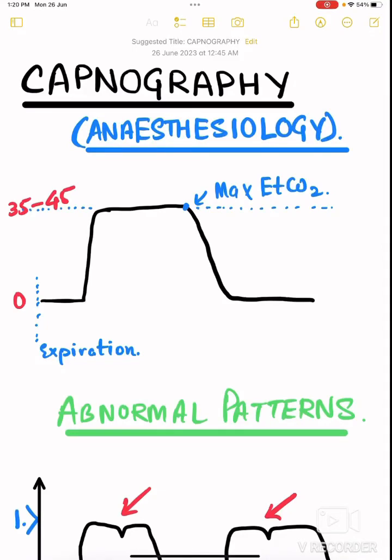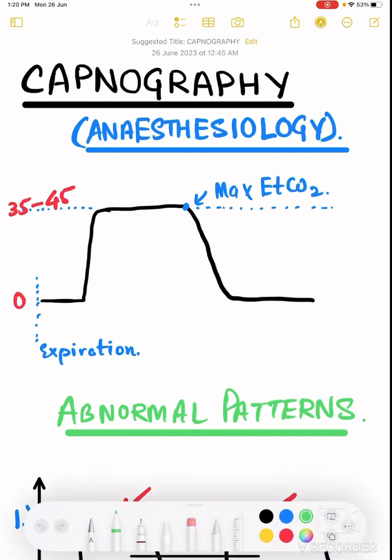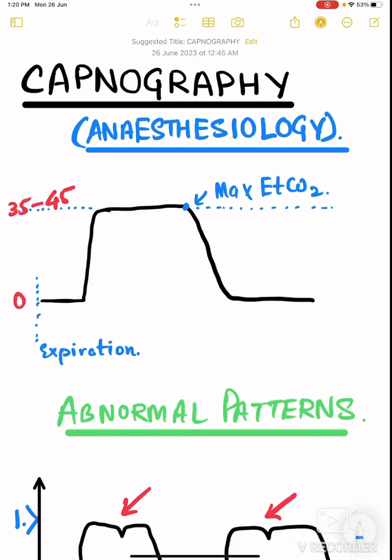Hello guys, in this video we are going to study about capnography, which is a topic from anesthesiology, and a lot of questions are asked from it. Right, so here you can see this is a photo or a graph of the capnography, which we can see in an anesthesia machine, and we have to know about it.